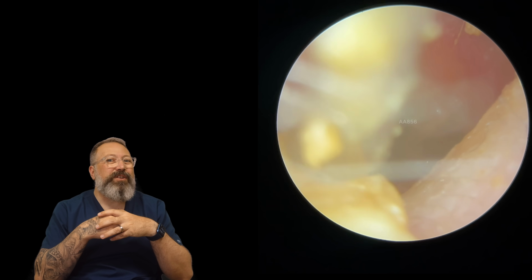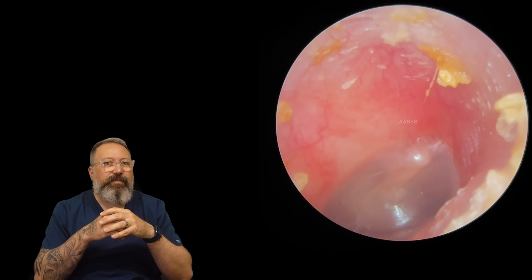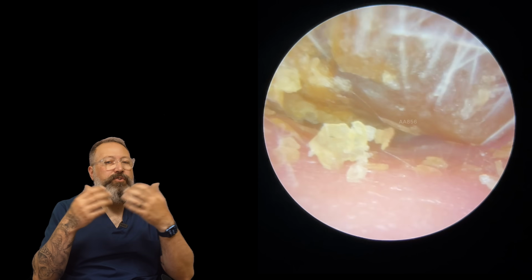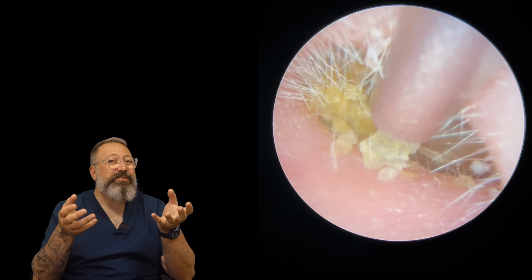Don't forget the ear canal walls are quite sensitive. So if you do see little tiny bits left behind, that's fine. It's not going to cause any problems for the patient. The patient can hear really well. We should have some wax in the ear canal anyway, and sometimes it's just a little bit too tender for us to remove.